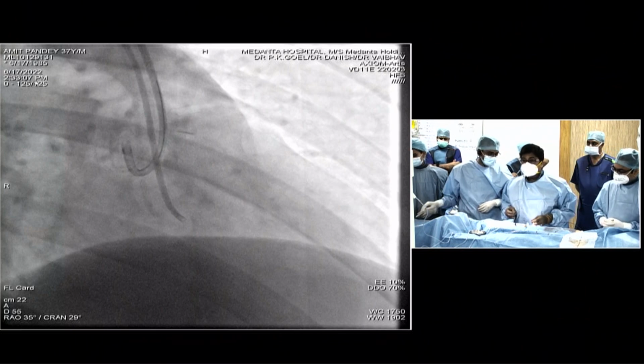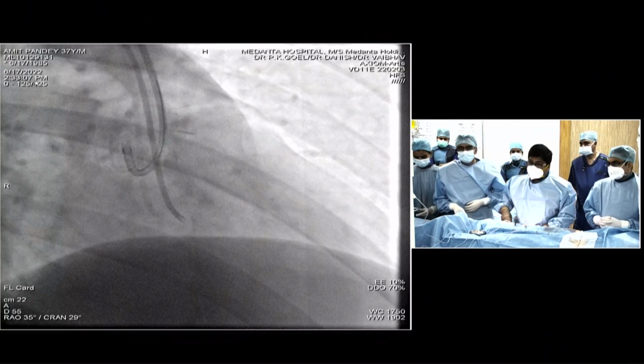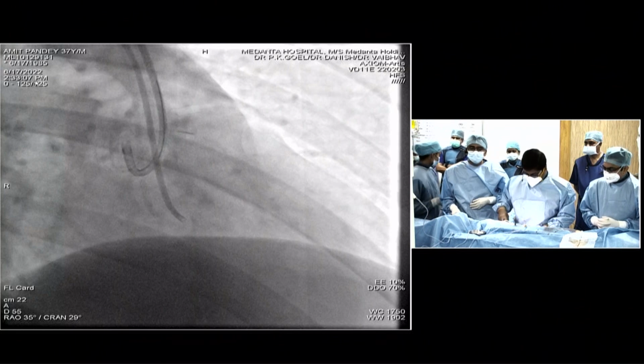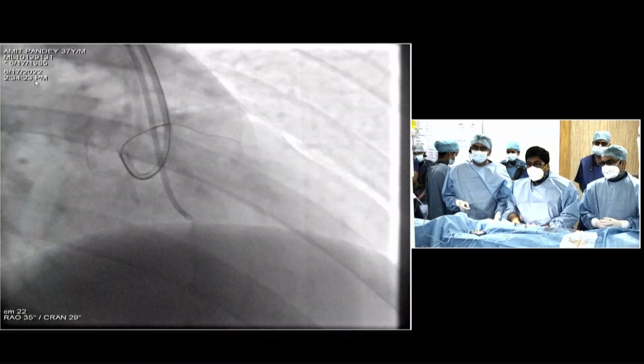So I just used a Caravel, for discussion's sake. We're just going to discuss. I have not used specifically a Corsair Pro. Each one of these catheters has strengths and weaknesses, as you know. Caravel actually is better than Corsair in terms of visibility, yeah, that might be true.